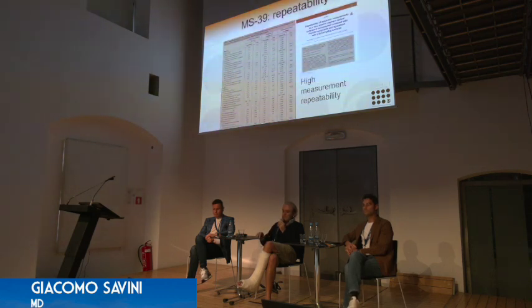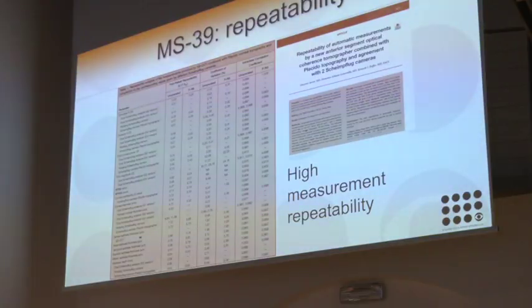In this preliminary sample, we did not assess the repeatability of all the other measurements taken by the MS-39. We already published them in 2018 when the machine was made available, and they were excellent.